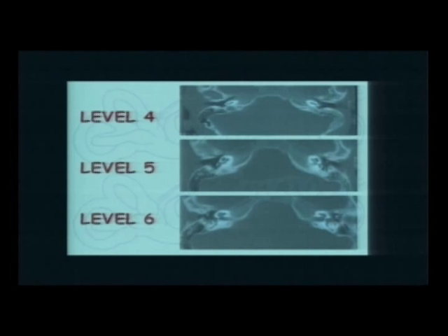And then here we see this is still the basal turn of the cochlea because it's going up now. This is the high part of it, and a small piece of the middle turn of the cochlea, and then we can see the internal auditory canal. I like looking at this side here, it's more clear. Let's have a look and revise everything.